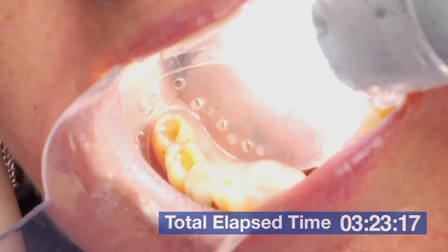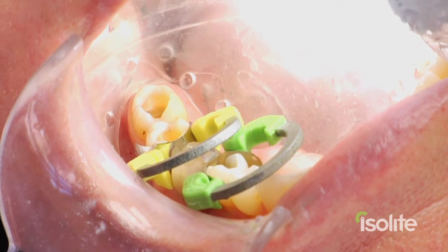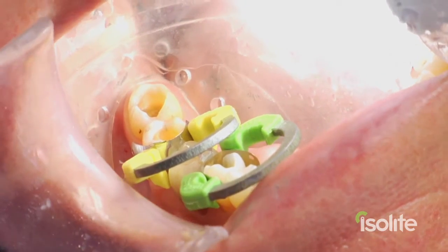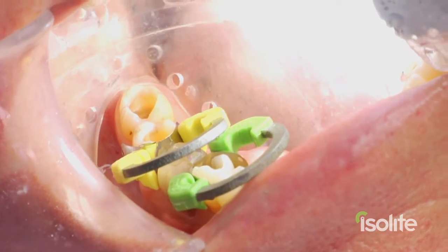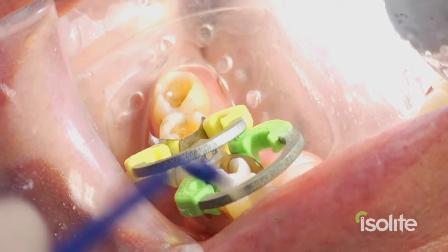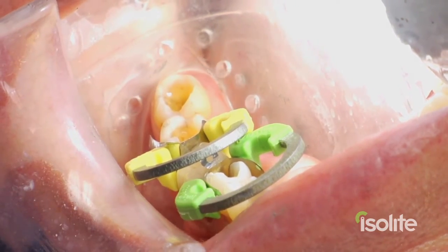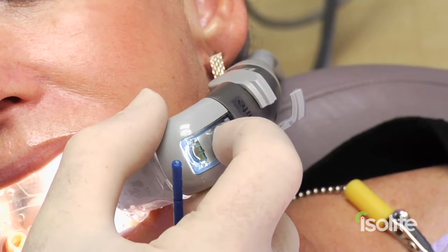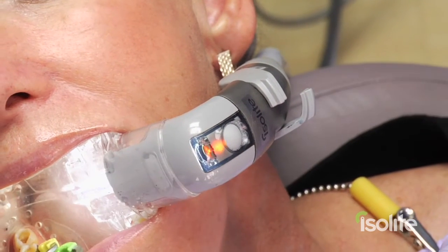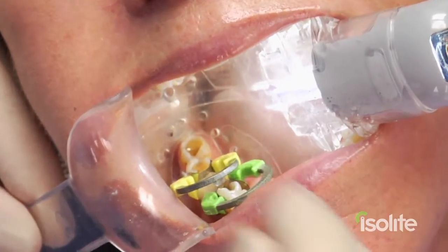Preparations are done. A unique feature of Islite, unlike any other system on the market, is the total ability to control the amount of light that enters the mouth. Bonding agents and composites are extremely light sensitive. By double-clicking the light button, this reduces the amount of light output by 90%, giving us total safety over any premature set of composites or bonding agents.